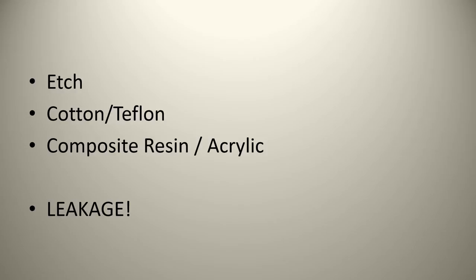So finally, after we've etched, we've irrigated the excess etchant off, we dried things off, and put our Teflon inside, prior to putting any composite resin or acrylic or flowable composite resin in there, I usually like taking some bond as well, some bonding resin, and just putting that in and around there. Once again, just to help make sure that we have an excellent seal here.